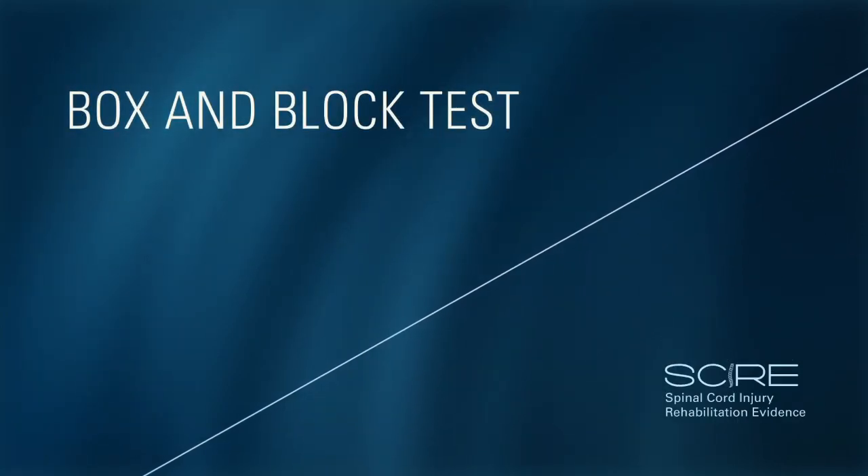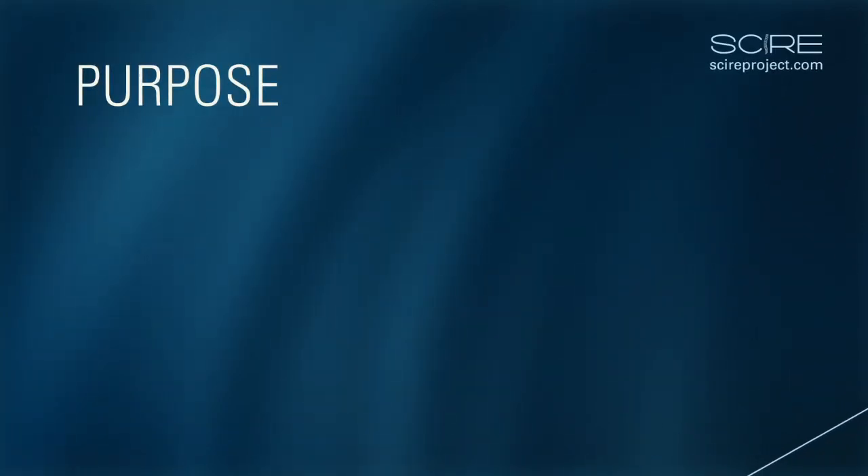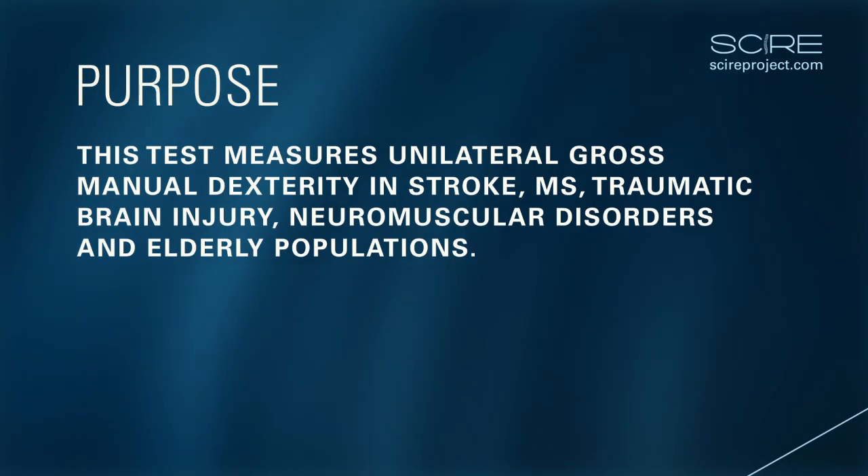Box and Blocks Test. The Box and Blocks Test is used to measure unilateral gross manual dexterity. It can be used in a wide variety of populations including stroke, multiple sclerosis, traumatic brain injury, neuromuscular disorders, and the elderly.